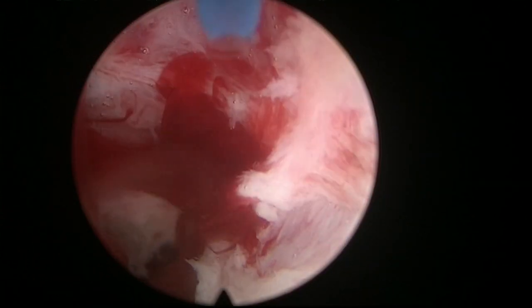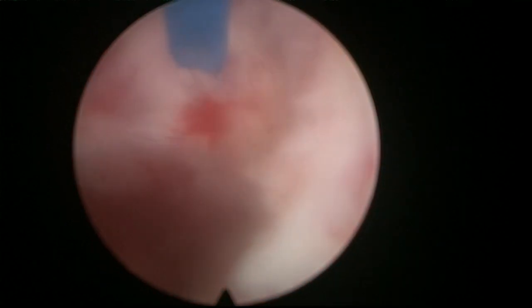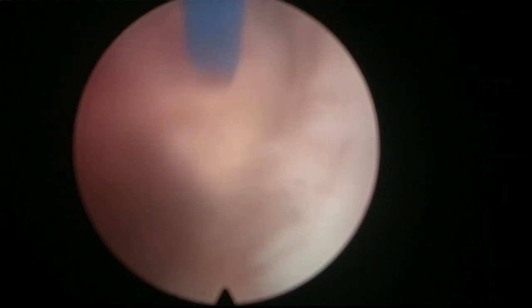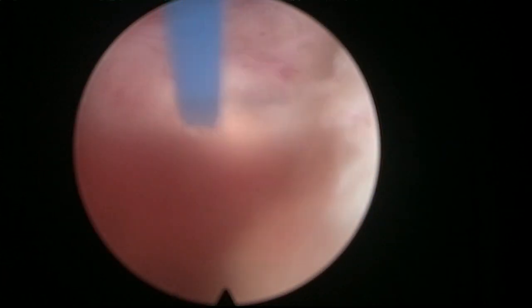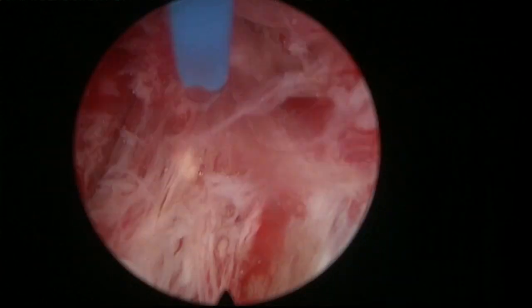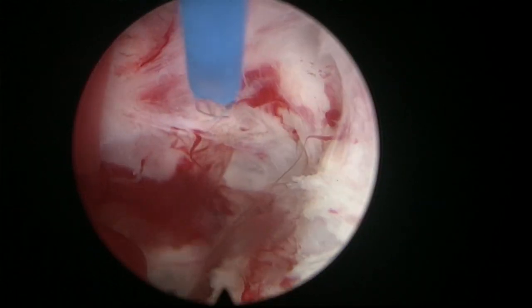It's a little bit of a nuisance, no? It's a little bit of apical bleeding. Okay, there's a vessel there. Let's see if we can control that one. There's a number of them, huh? Okay, so it's going to be a little bit bloody. Anyway, this is 12 o'clock. This is the white line we marked.